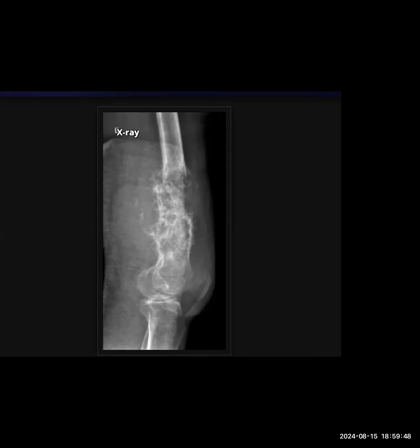So what is transarticular metastasis? Transarticular metastasis would be involvement of the joint cavity. There will be synovial thickening. Okay. In this case, if you were to say skip metastasis, what would you tell your technician? I would include the one joint proximal and one joint distal to that lesion, so as to look for skip metastasis.